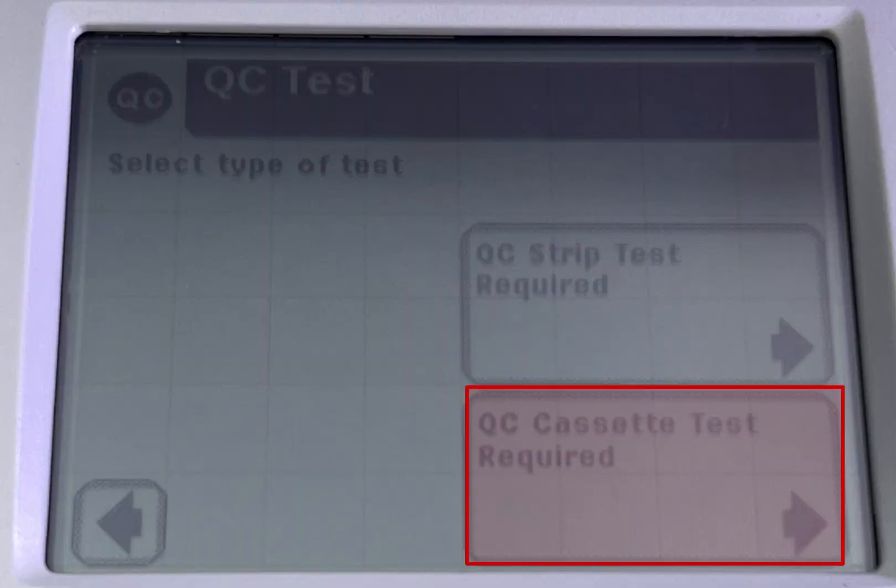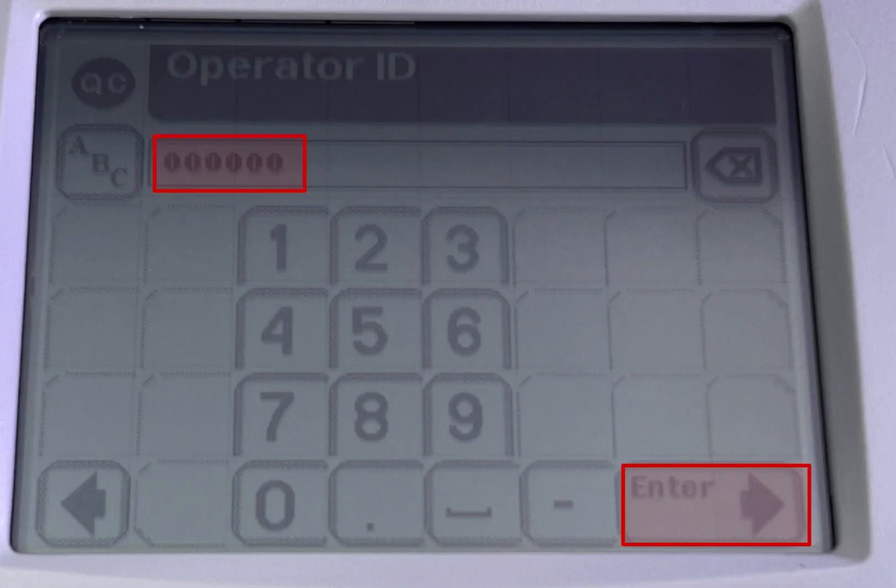Click on QC test due. Click on cassette test required. Scan your ID and click enter.